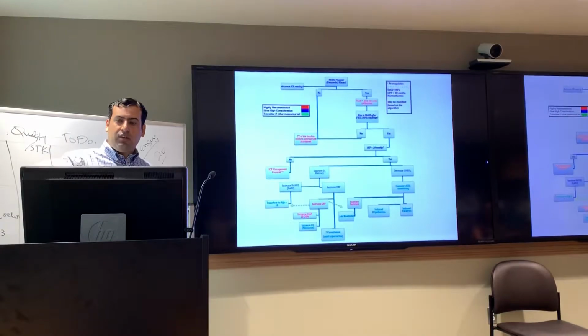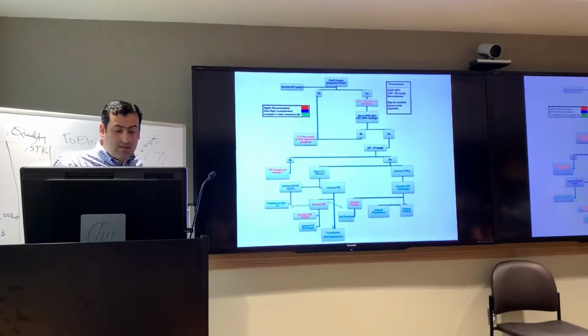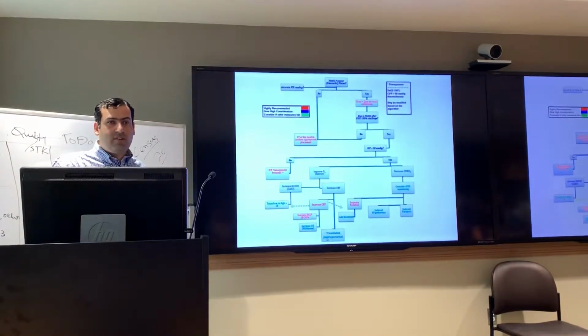Again, to review it briefly, you check if the ICP is correlating. If not, do a CT. If it is, do oxygen challenge. If it's not working, do a CT. If it is, check the ICP. If it is high, treat ICP. If it is low, either increase the delivery or decrease the use of it. To decrease the use of it, with a guide of EEG, increase sedation or induce hypothermia. To increase delivery of oxygen, either increase capacity of delivering by transfusion or increase cerebral blood flow by CPP or MAP or cardiac output. And don't forget about vasodilation. I think, again, this is for subarachnoid patients. Usually vasospasm is not a big problem in traumatic patients that we know.